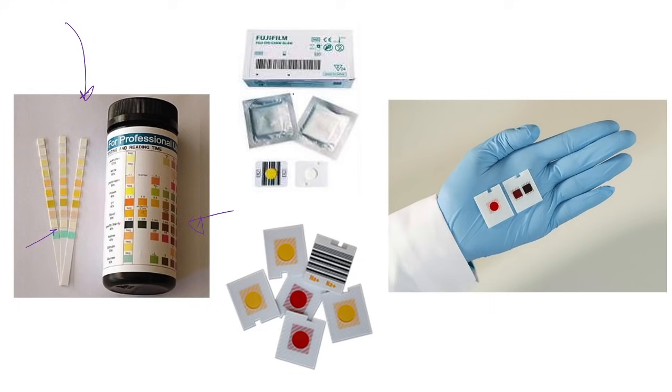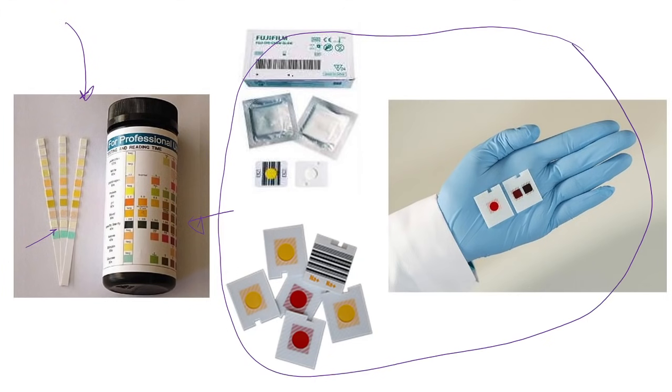Now the rest of this, these are actually your dry chemistry slides and an example of your thin film analysis technology. Diba? Diri pa lang, this is really the actual size of this. And this is actually very thin. Nipis kaayo siya, naa na sa sulod ani sa inyohang template tanan ninyong reagents na needed. Now, all you have to do is just to add your sample, and then leave it for how many minutes, and then i-read na dayon siya sa inyong machine. It could be through the use of your spectro, commonly spectro.